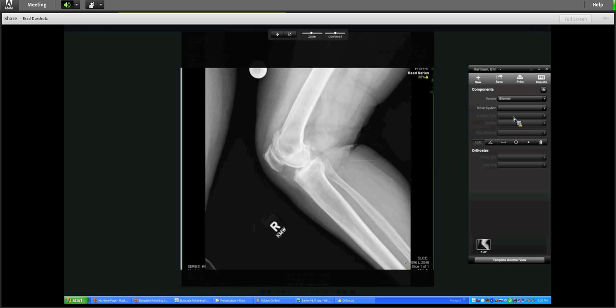Now I'm going to come in and grab the Vanguard components. This was a CR interlock case. And now let's come up. I'm going to start moving the components. You can see the different anchor points now for the lateral view. I'm just going to simply slide this femur down around a little bit, come back and maybe give it another tweak up. And quite honestly, the 65 doesn't look too bad in this particular view.